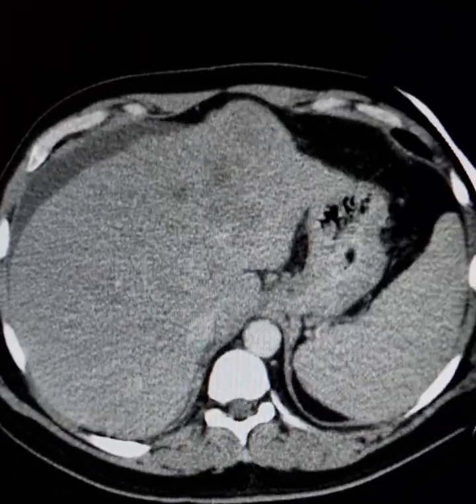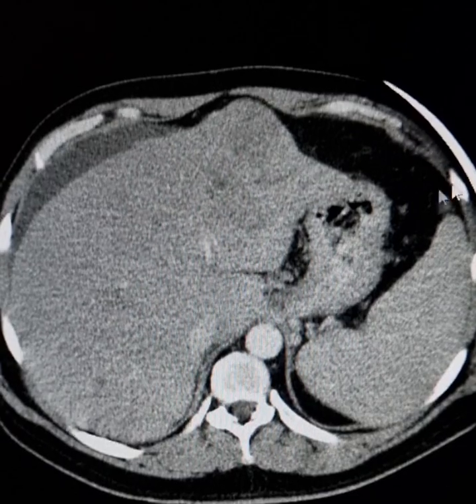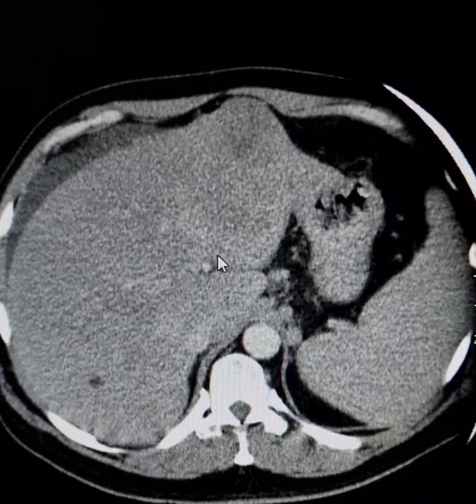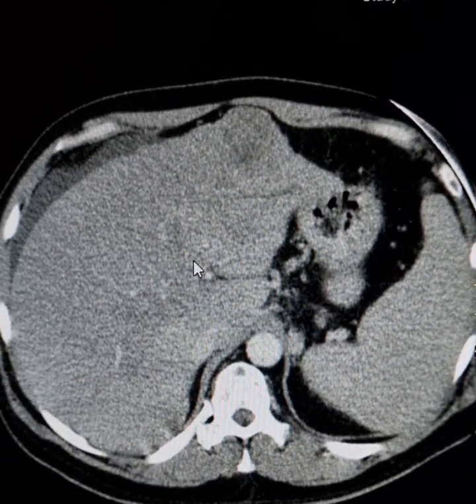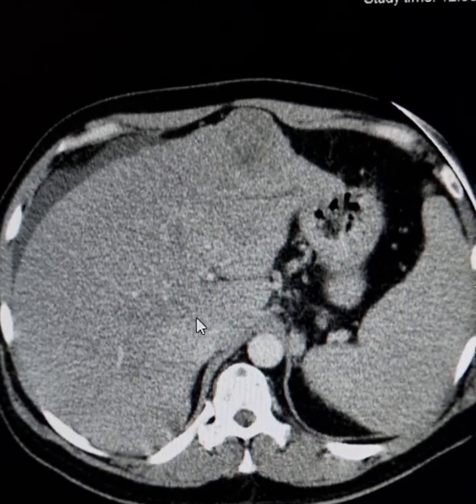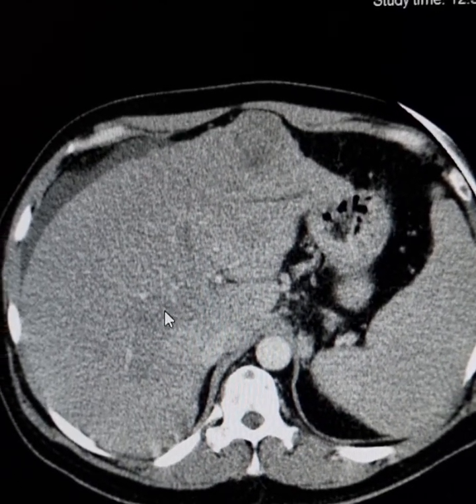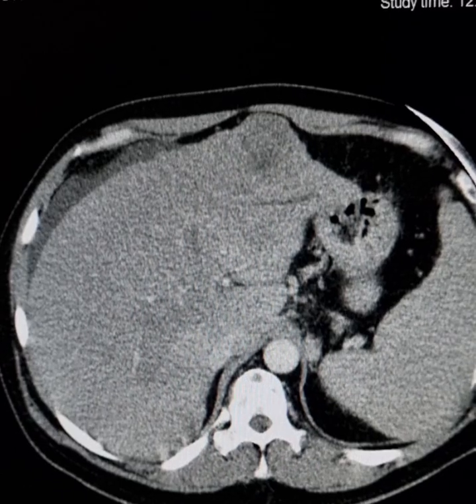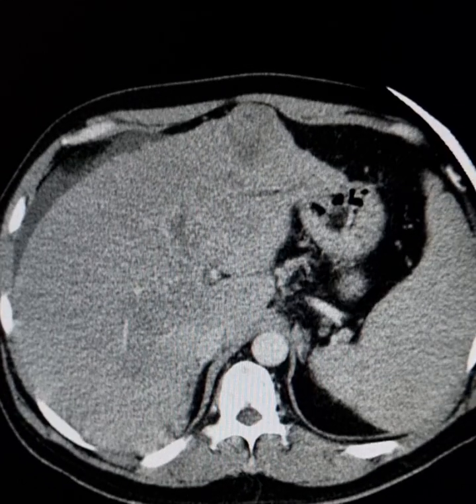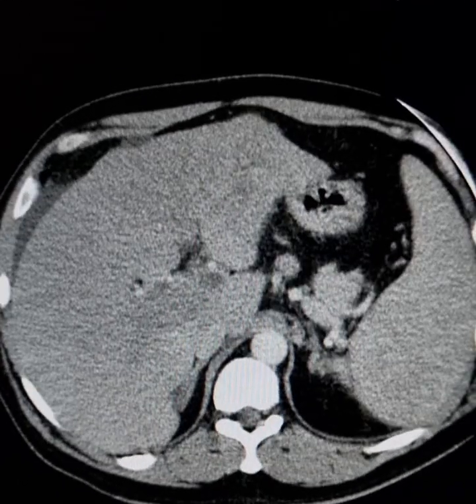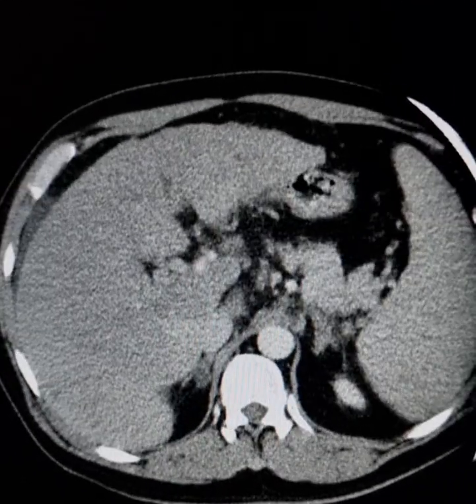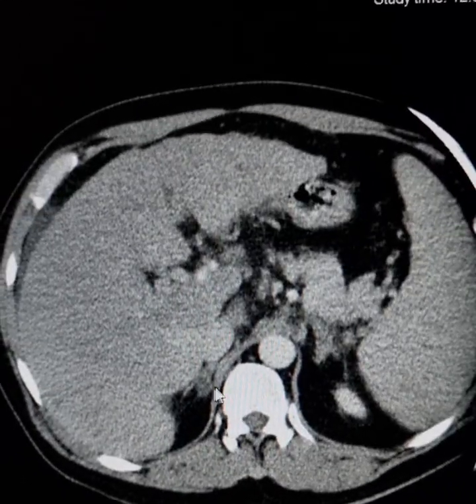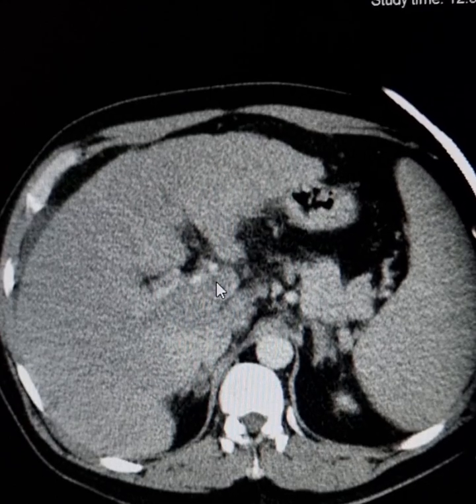Tumor thrombus is also extending into both branches of the portal vein. Here is the left branch of the portal vein, this is the right branch, and this is the portal vein itself.